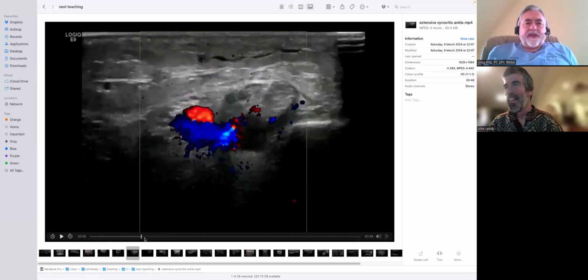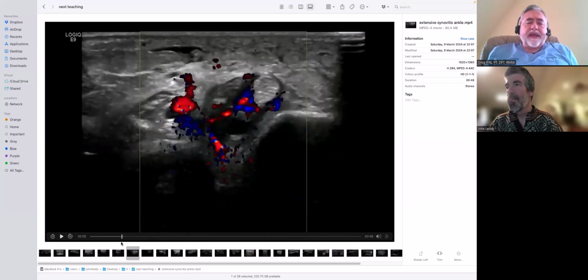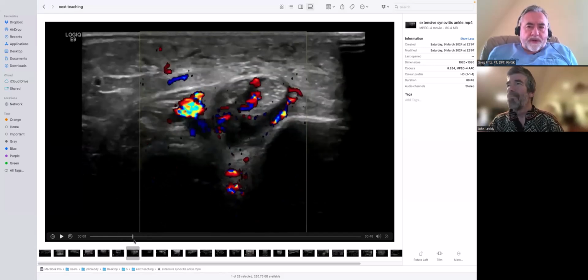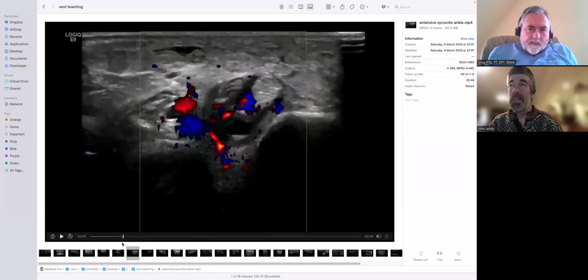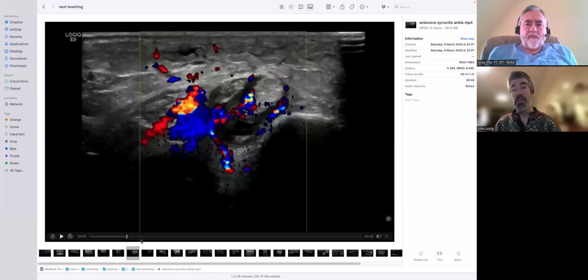Understand. Yes, the Doppler box. When you put that on, are you already completely set up to your refinement? In other words, is it preset, or what do you do? It should be, but I'm using lots of machines that other people use, and I like to adjust things, so I don't necessarily have one fixed way of doing it. I like the box coming from the top of the screen, so I like it to touch the top of the screen and come down. I don't like it to fill the whole screen because it slows the picture down.